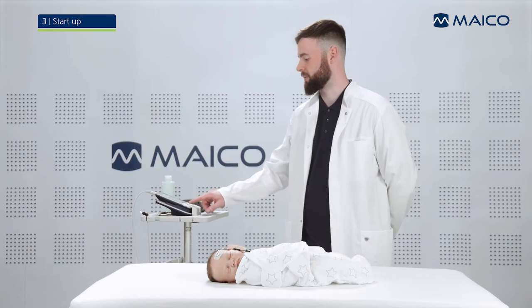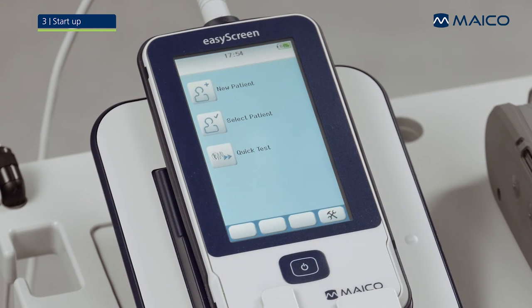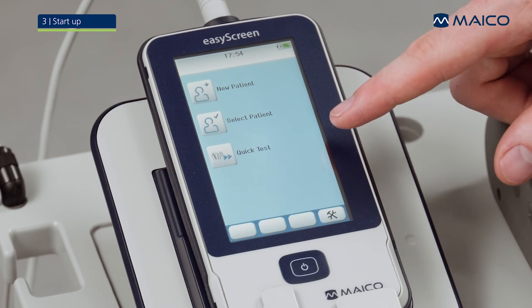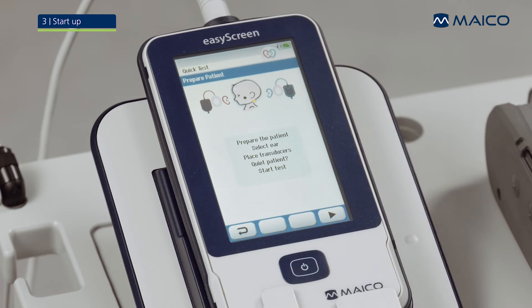Press the home button on the EZ-Screen once and wait until the home screen is displayed. Now the EZ-Screen is ready to go. You can either create a new patient, choose a patient whose information is already saved on the device, or start a quick test without entering patient information. The first test screen reminds you about proper screening preparation before starting a test.